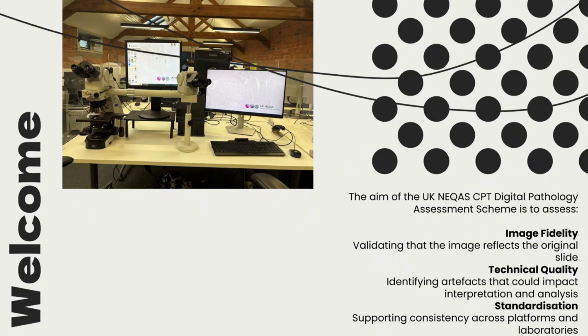We look at the technical quality, how the slide's been prepared. Are there any artifacts that are going to affect the digitisation of the glass slide? And is it standardised? Are our participants doing it the same way? How are they getting this image? Even though we're called UK NEQAS, we're not just a UK-based company, we're a global company, and we have a lot of international participants as well.